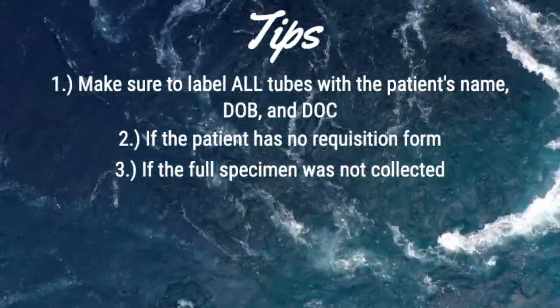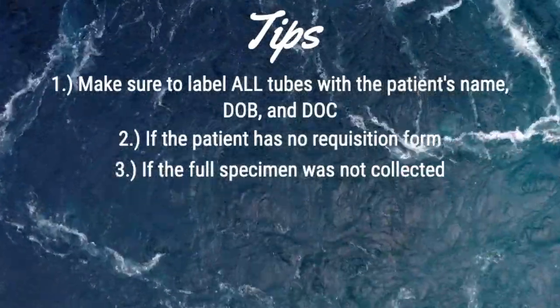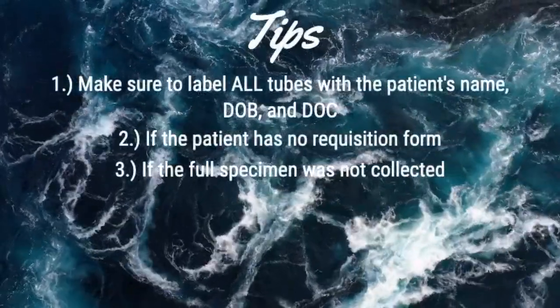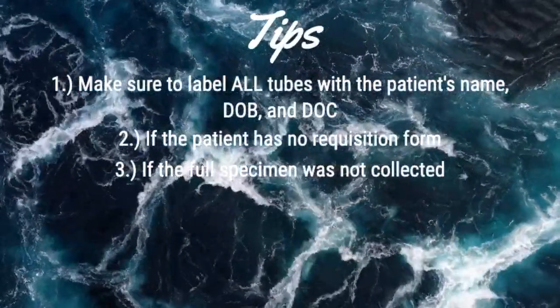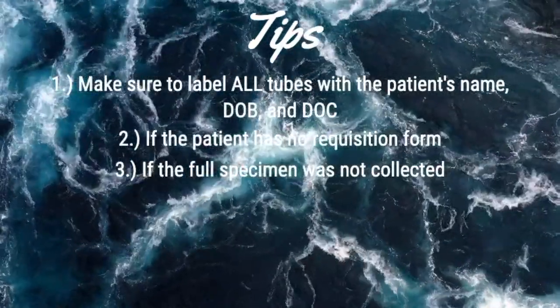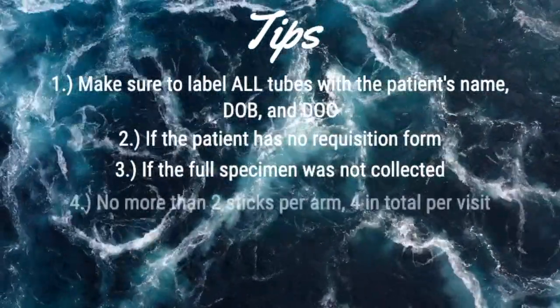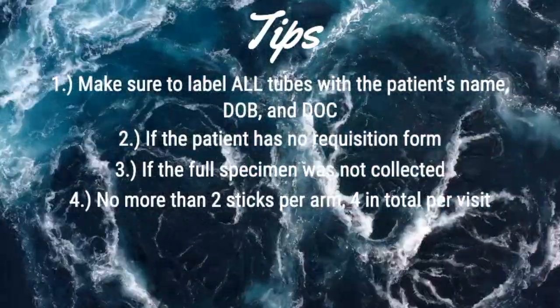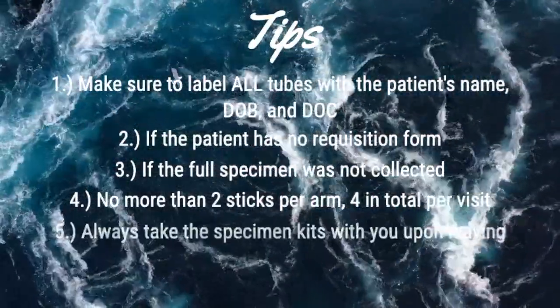3. If you weren't able to get the patient's whole specimen during the appointment, all we ask is that you include details of the draw in your email when you send in the pictures, which we will go over next. All we would need is a narrative on the gauge of the needle, where it was attempted, and how many attempts were made, to include in the clinical notes. Please note, no more than 2 attempts per arm. 4 attempts in total are allowed.